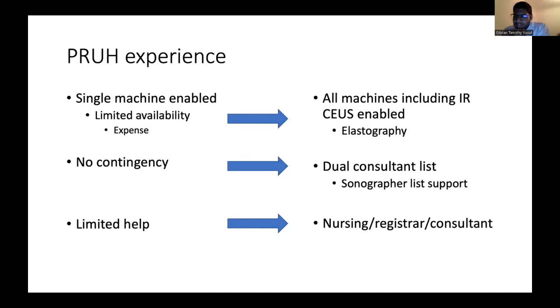Before there was no contingency, we are training up a consultant to cover my list as well. And there are more people becoming comfortable. There is also a great degree of sonographer interest, which I'd actively encourage. Before we had limited help. Now we have nursing, registrar and consultants. My nursing staff are brilliant and do the cannulation for me before the patient comes in the room. So actually you can have these setups and it is available.